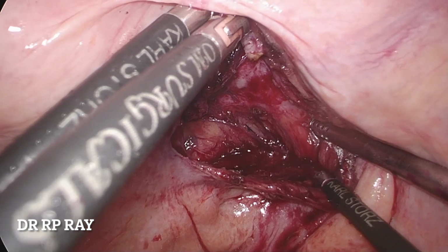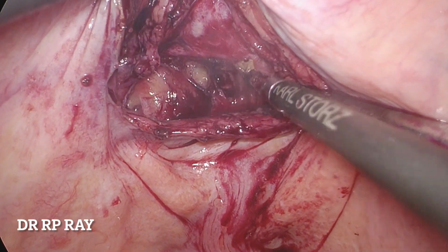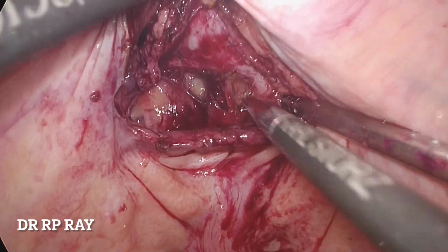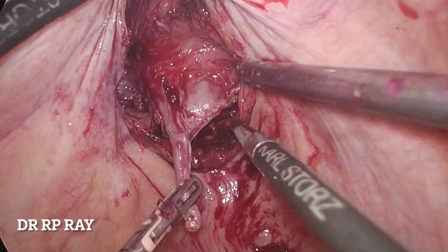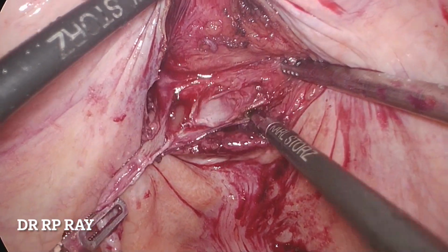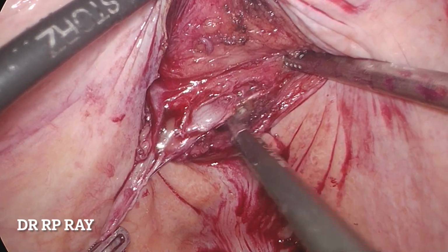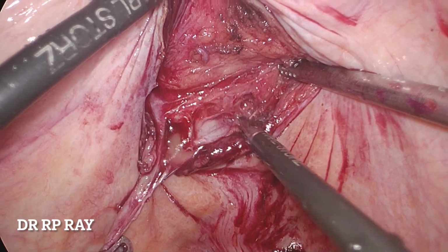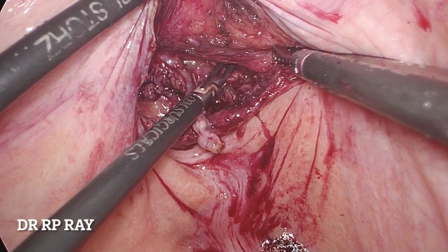Now posteriorly the fascial attachments are separated from the seminal vesicles. In Indian patients there are a lot of adhesions in the posterior aspect. The seminal vesicles are freed from the surrounding structure progressively and the dissection is continued.